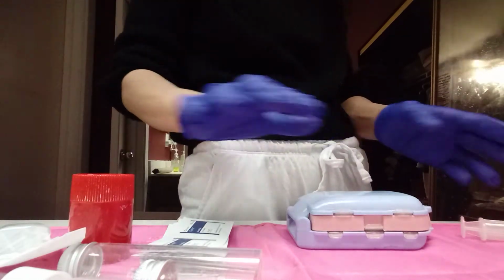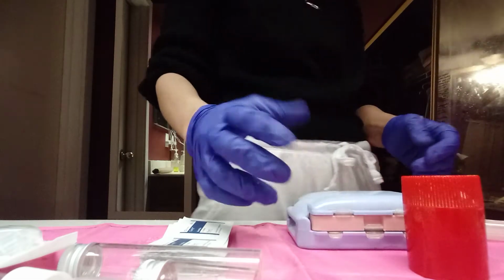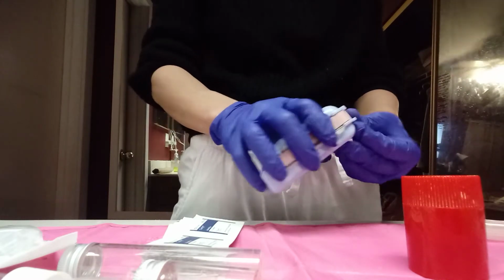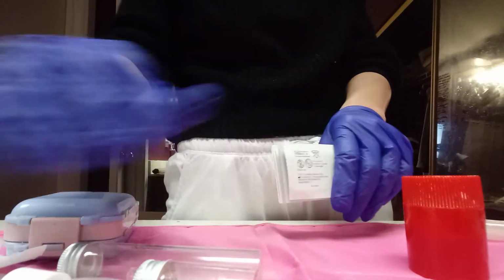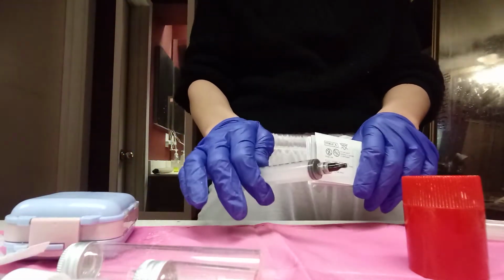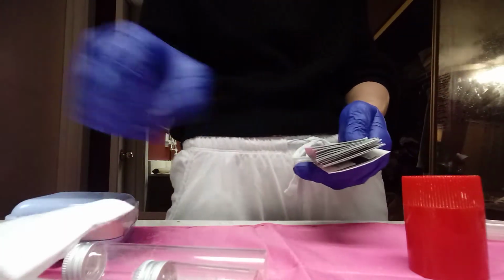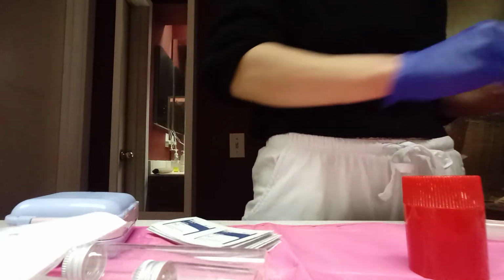Okay, now we're going to move on to the medication. Really what I bring is my crusher. I bring my pill organizer. And I bring a lot of alcohol. Another thing with the blunt tip, you've got to clean it every time. Make sure there's no medication stuck to it as well. I do the same thing even with new 10cc syringes. So you can see I bring it like a card stack. So I'd suggest doing that.